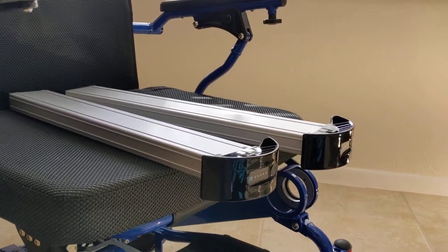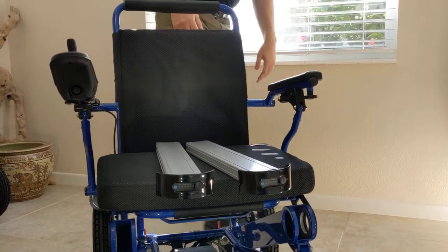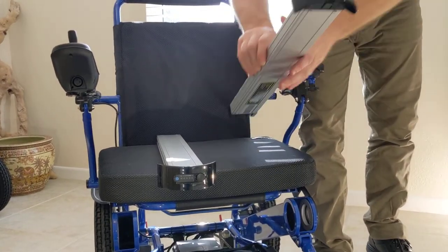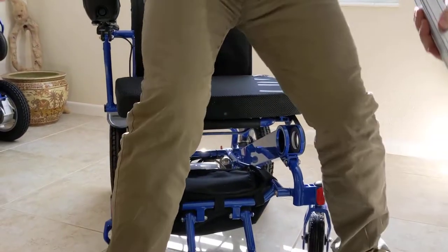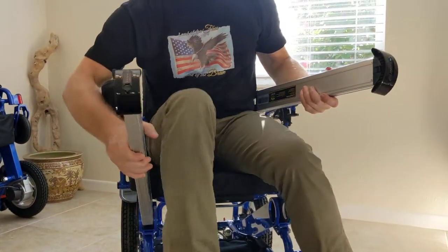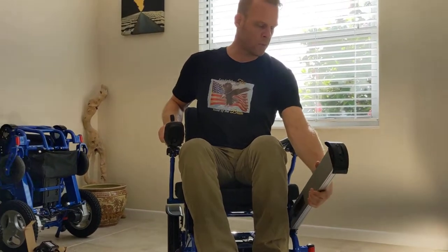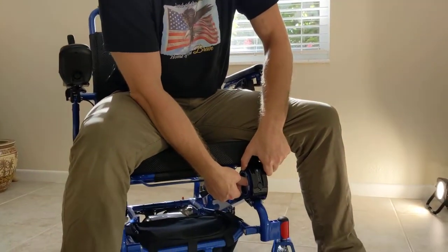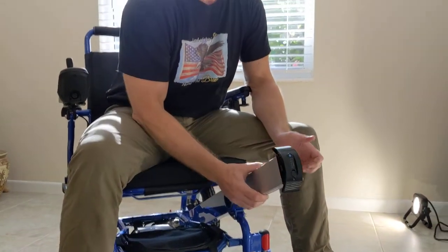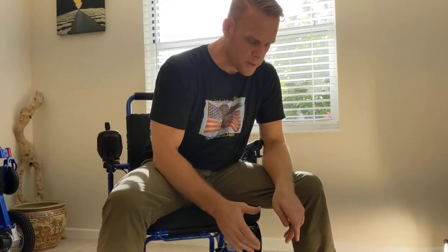One of the things people really like about the Electra 7 is the placement of the batteries. While sitting in the chair, with a relatively limited range of movement, you can put the batteries in or take them out. That's why a lot of people prefer this model of chair.